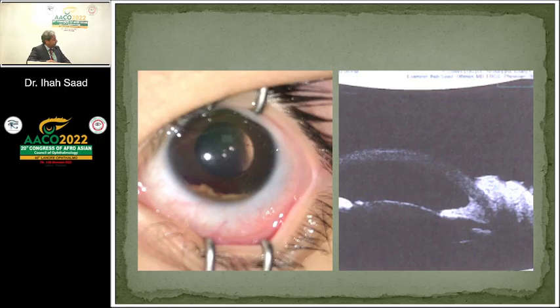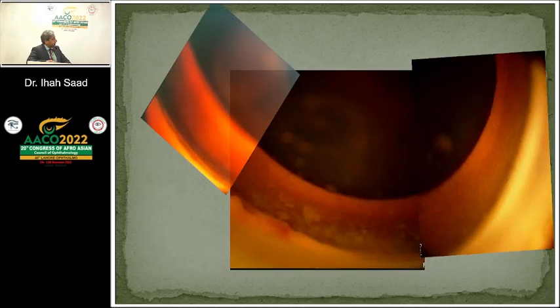The patient came with this mass in the anterior chamber that you can see on UBM. And not only the mass here, there were seeds everywhere. This is the mass, and these were the seeds on the anterior capsule and the iris. The other eye is quite normal, the fundus also is normal. So, how many of you have seen retinoblastoma in the anterior chamber?